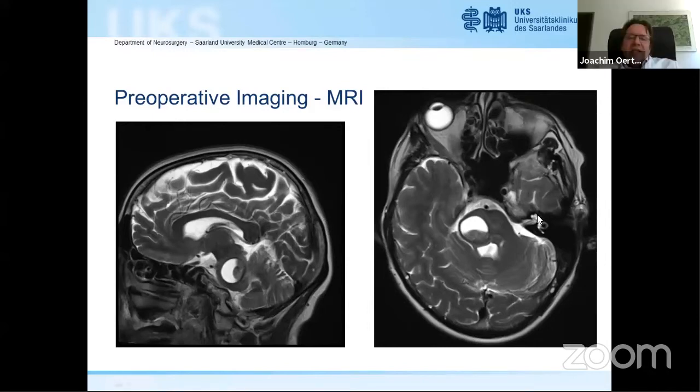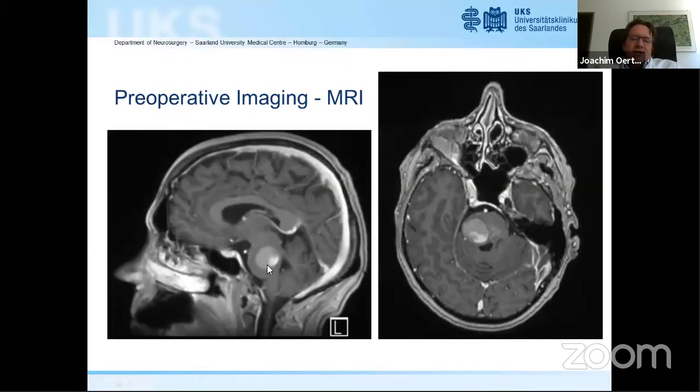Could be maybe a big aneurysm. Well, aneurysm. The only thing which is against aneurysm is that it's really purely in the pons. There's no contact to the subarachnoid space, so it should not be in contact with any vessel. But it could be like an angioma with an aneurysm. But when we look at the images, we don't see any vessels in this area.